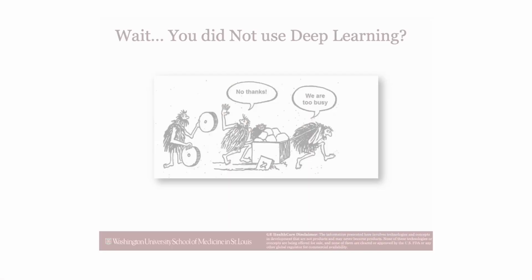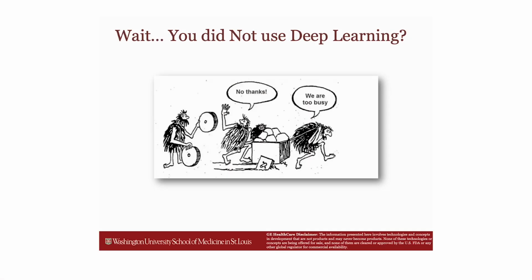So you might be asking me this question. So I did not use deep learning, correct? I used feature engineering. I used feature engineering on a powerful, existing, and widely available platform. That's the 12SL software, a platform that includes this information and the processes that I already need. The approach that I took was to improve upon something that's already good, not replace it, a process that I find to be more practical and immediately useful.